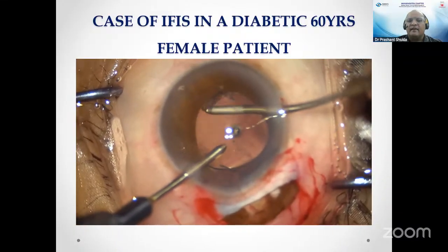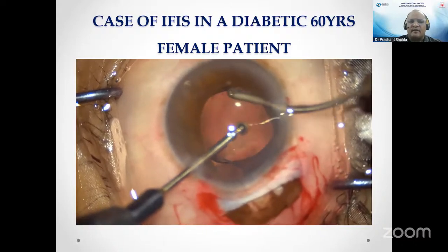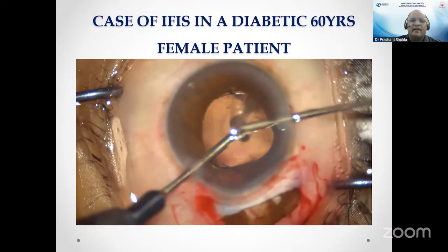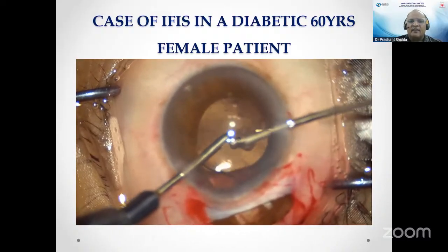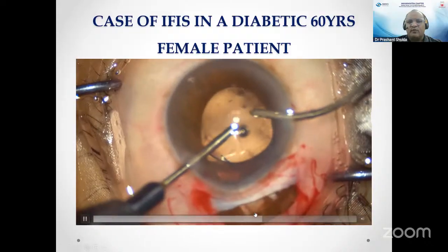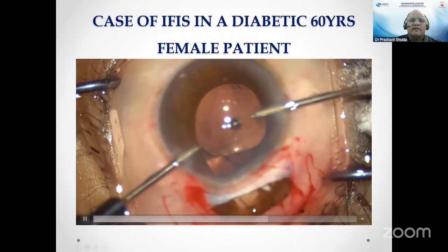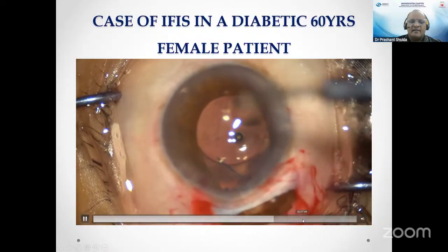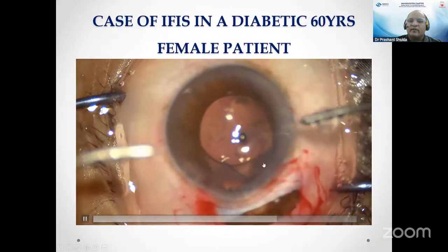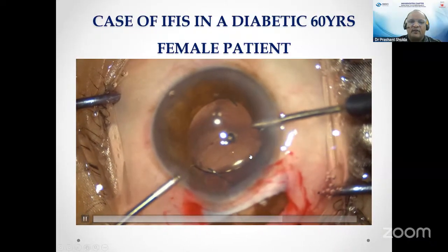So the intraocular lens worked as a scaffold, so that even if we have a collapsed chamber, there are very few chances of having a posterior capsule rupture or further complications. There was a good amount of cortex which was then removed comfortably. Then after the iris was reposited back, some more cortex is left somewhere here. Yes, there's some more cortex.